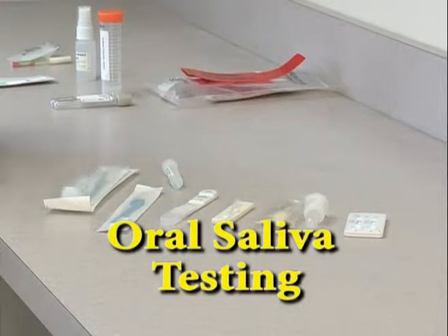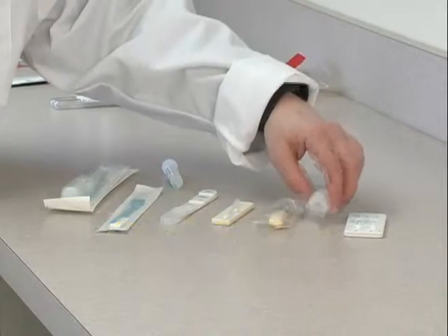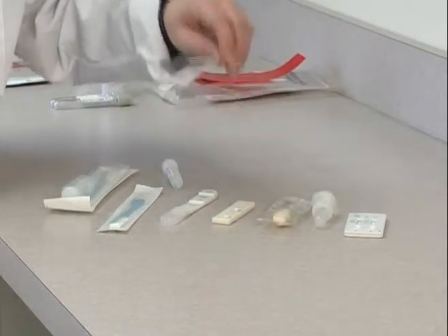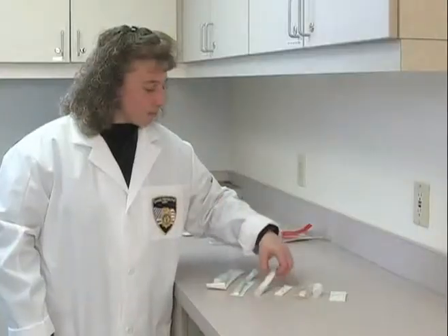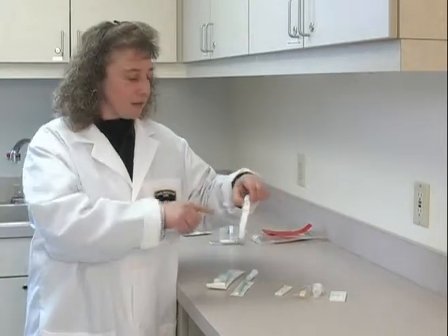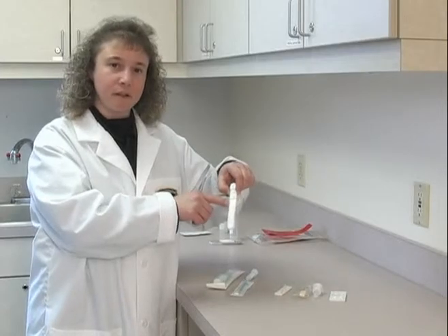There are different kinds of oral saliva testing. This one uses a lollipop, this one uses an eyedropper, and this one you actually put in your mouth — it soaks up the saliva and then you'll be able to read the results on the stick.